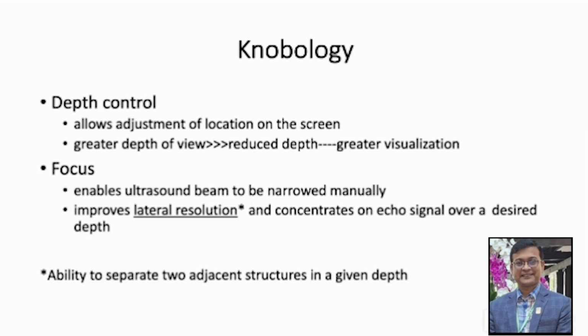What is the lateral resolution? This is the ability to separate two adjacent structures at a given depth. Just think about a camera. When taking a picture, we first focus on a particular object and then we adjust it. The same thing happens when I do sonography for a particular organ, like the liver, the spleen, the diaphragm, or any pleural pathology. We have to adjust the depth first, then the focus.